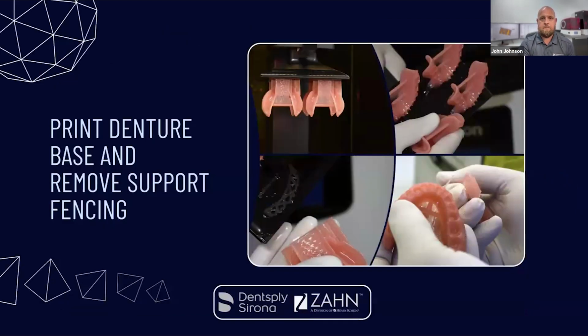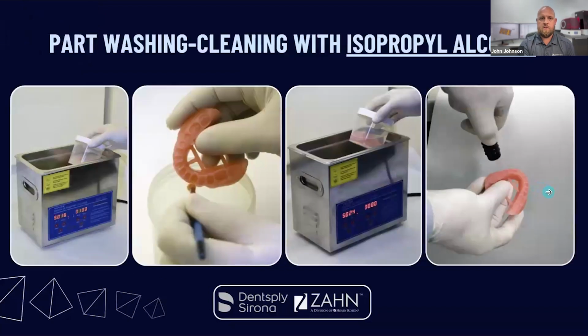This is an example of what that print base looks like coming off of a Carbon. As you can see, those were printed vertically, basically on their face from the buccal aspect. Like I said, they're going to have to go back and finish all that stuff, and we've moved on from that. I told you before, you've got to clean all your parts in 99% isopropyl alcohol. It really needs to be an ultrasonic cleaner, not any of these other washes or whirls. It really needs that frequency to get that residual resin off of that print so that you're able to get back to just what CAD produced.